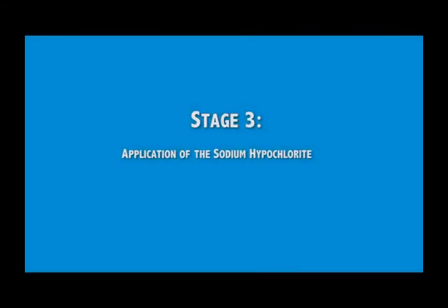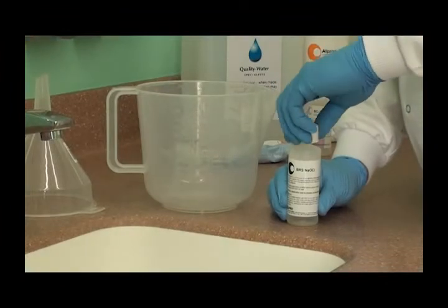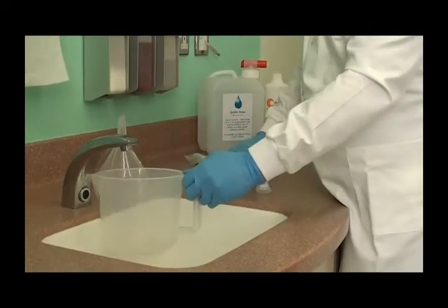Now the chair is prepped, we can do the biofilm removal. This involves using the chemicals in the kit, so personal protective equipment is strongly advised, and if you can, open the windows. The first chemical you need is the sodium hypochlorite, and you'll also need the jug and funnel. Tip the hypochlorite into the jug and add hot tap water up to the 1 litre mark. Stir to mix.